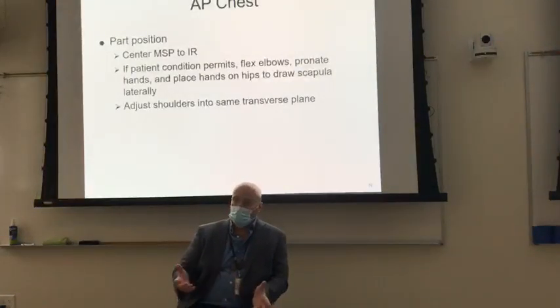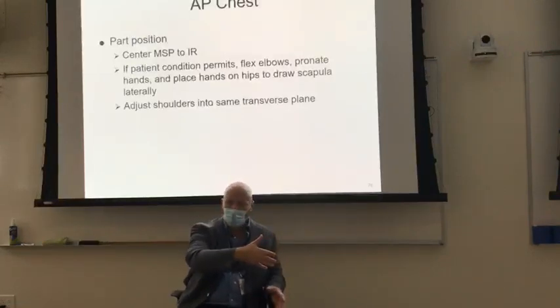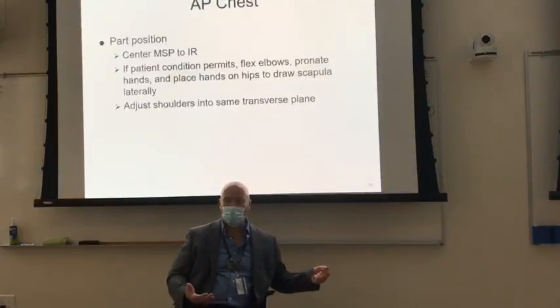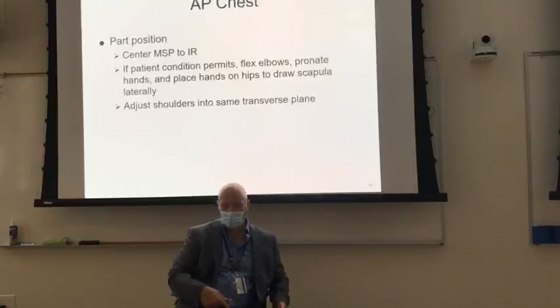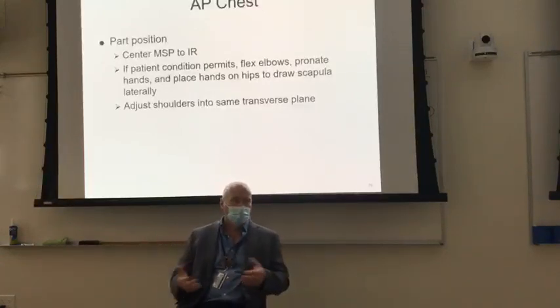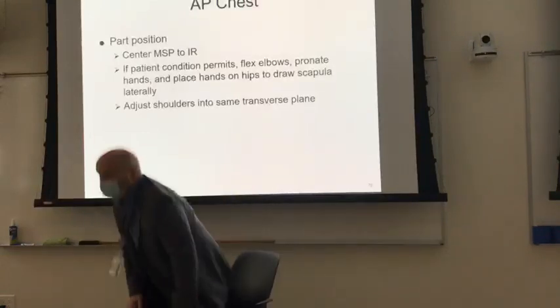So just tell them you're gonna straighten them up, whichever direction they are facing. If I'm facing more to my left, get on their left-hand side, grab that draw sheet if it's under their hips, and just give it a little bit of a pull. It doesn't take a whole lot. What'll happen is it'll pull their hips that way and the rest of them will straighten up. Okay, so use that draw sheet and straighten them up.